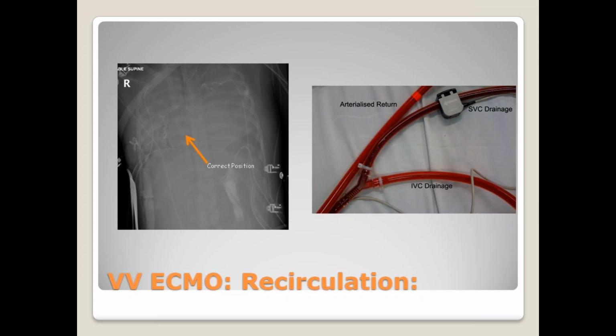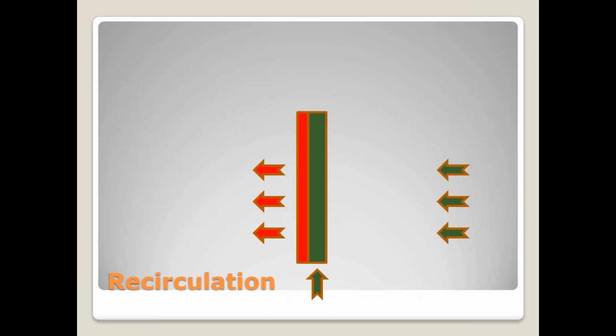That will also help you get absolutely non-recirculated blood. So the first choice, if you have to put an additional cannula, is a cephalad cannula, but it is difficult to put and difficult to maintain, so nobody usually does it. The alternative is to be in the mid RA. You go up to mid RA for arterial return. You keep the IJV cannula and don't let it go into the RA. Put the other one on the opposite side.